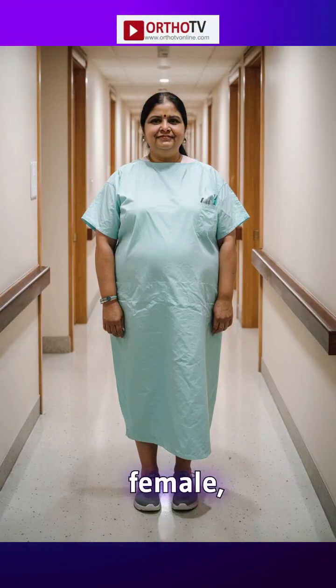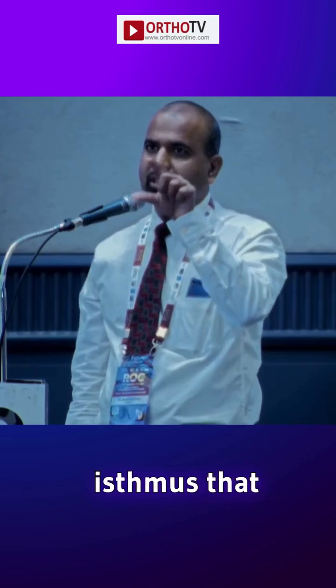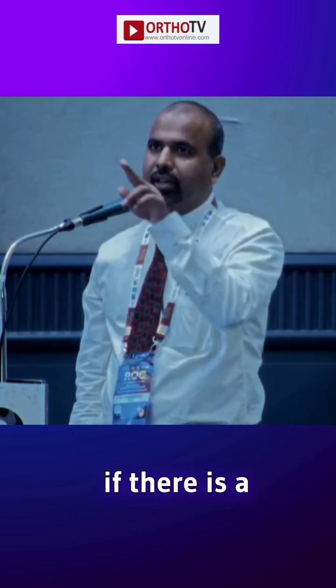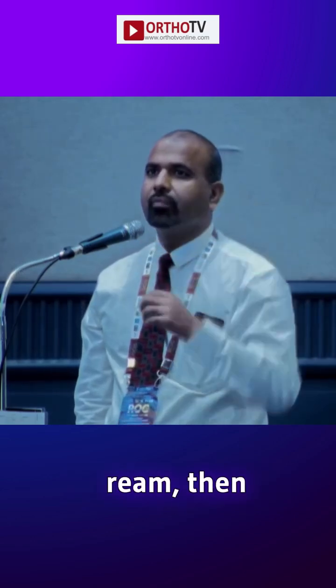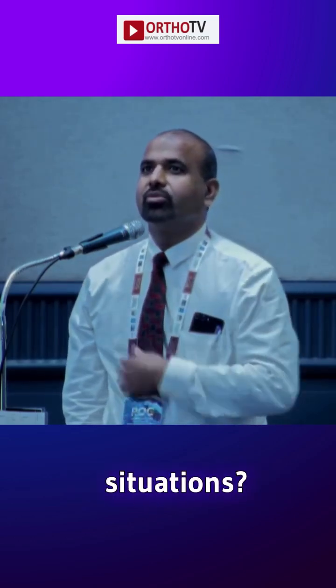In a short-statured female, we see sometimes when we have to revise, the amount of isthmus that you have is very small. And if there is a crack around the isthmus when we are reaming or when we are trying to ream, then what is the bailout in such situations?